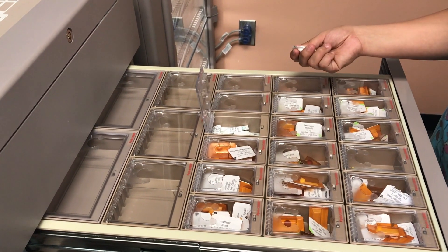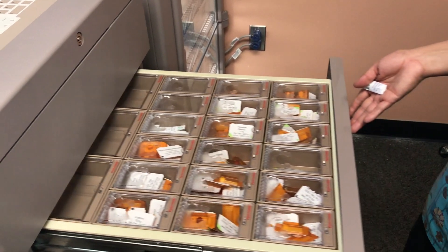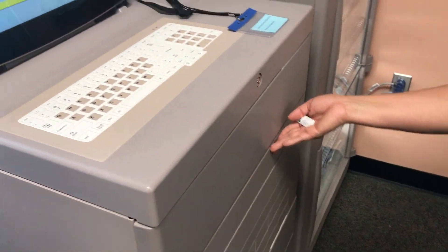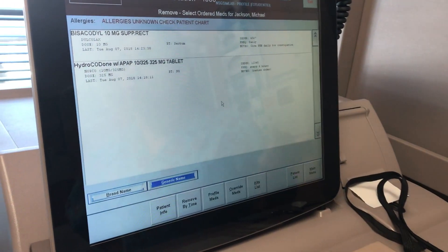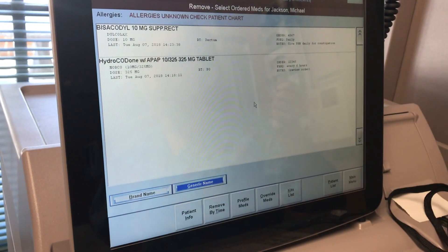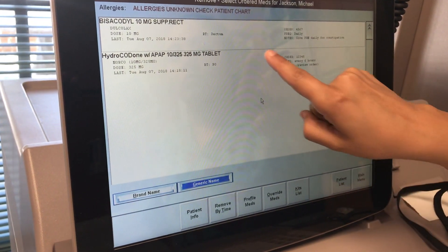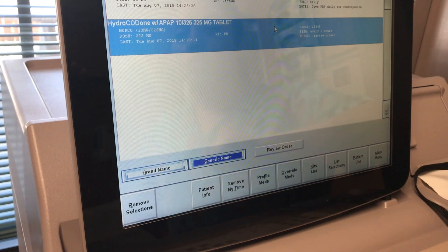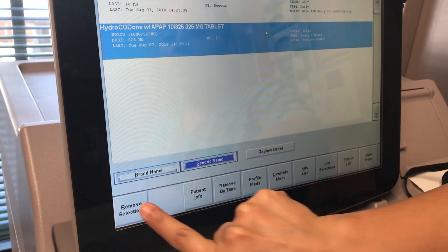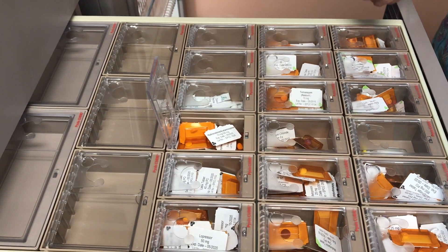I will remove one medication, close the pocket, then close the drawer. I also realized that I have to remove Norco 10/325 to manage the patient's pain. So I will select Norco 10/325 milligrams. Click Remove Selection. And again, the drawer with the corresponding pocket will open.